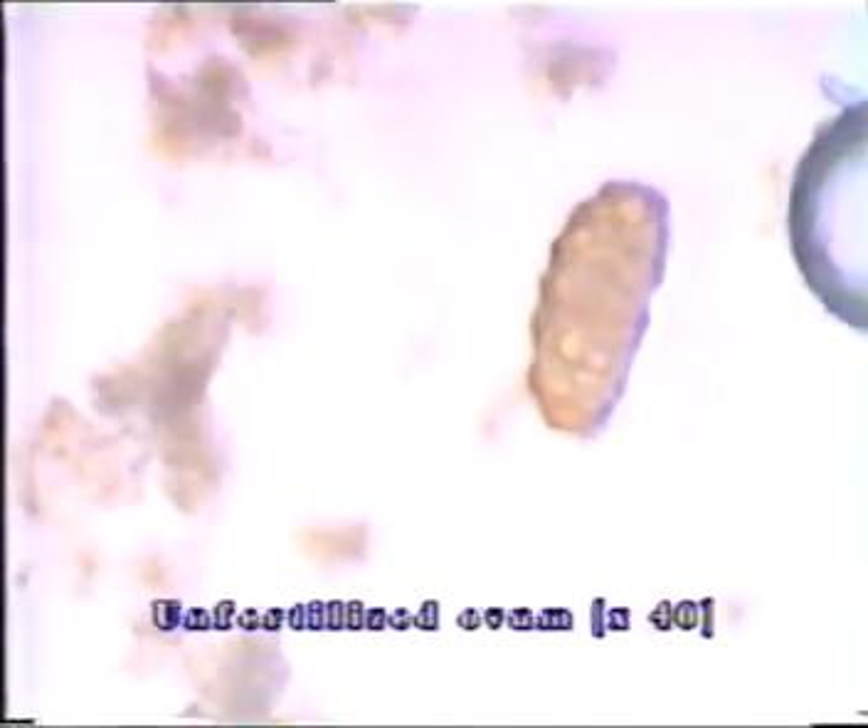Sometimes the outer coat is lost and the ovum is seen surrounded by the smooth inner coat. Unfertilised ova are also seen; they are rectangular in shape and appear vacuolated and disorganised. Occasionally in old stools, an embryonated Ascaris egg may be found with a larva inside. The egg may be corticated or decorticated.